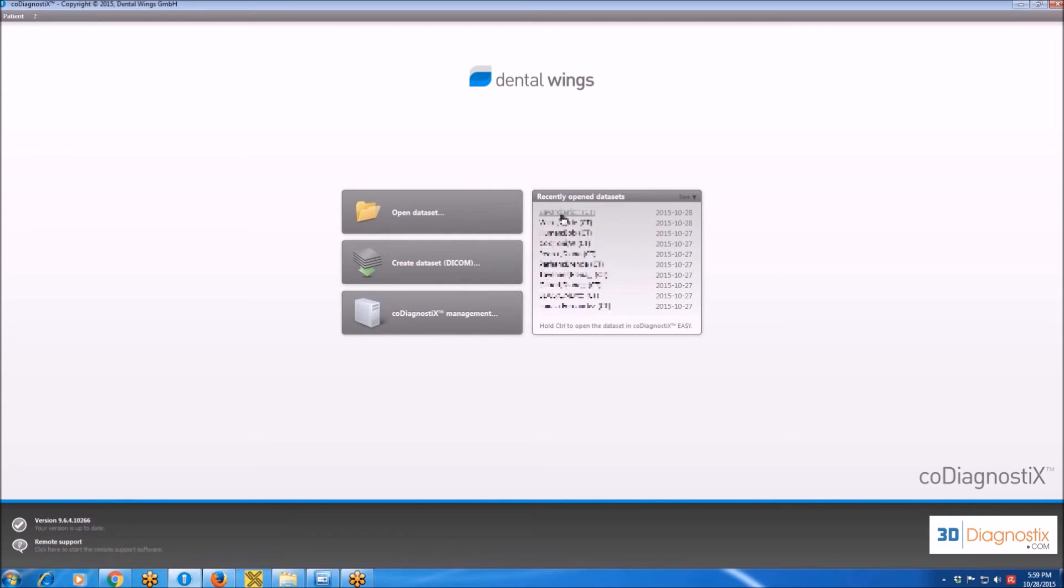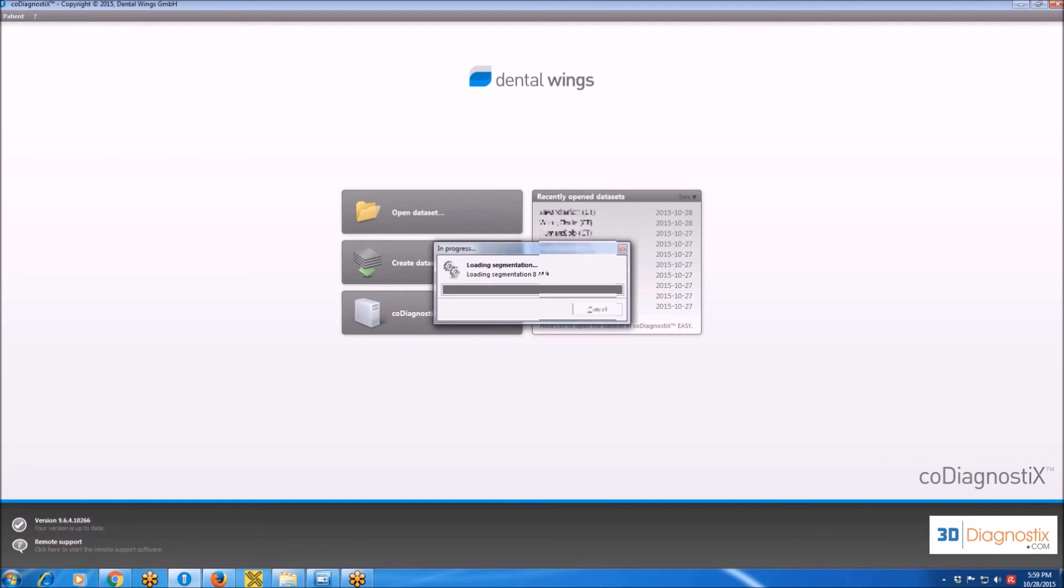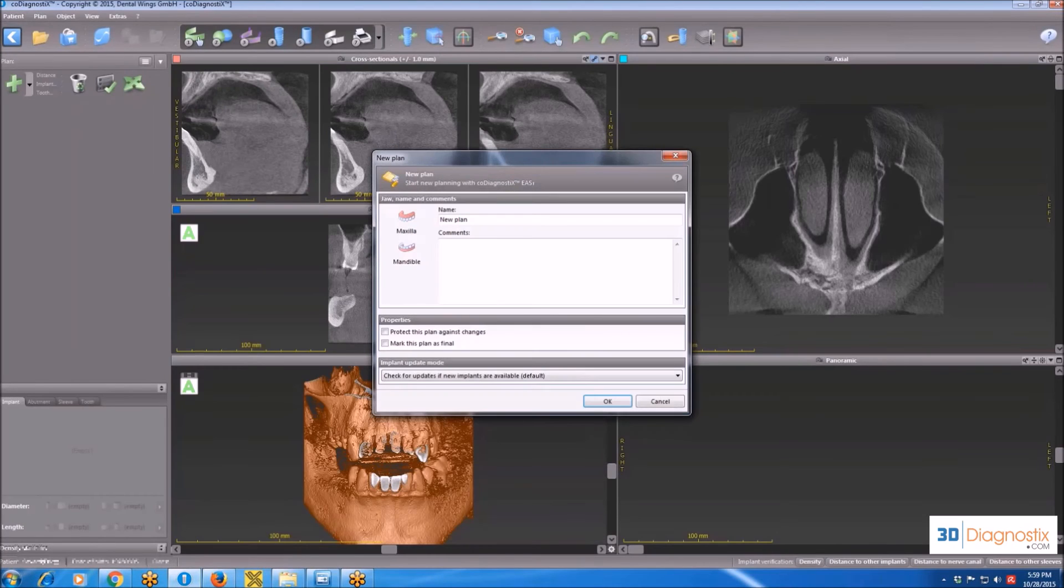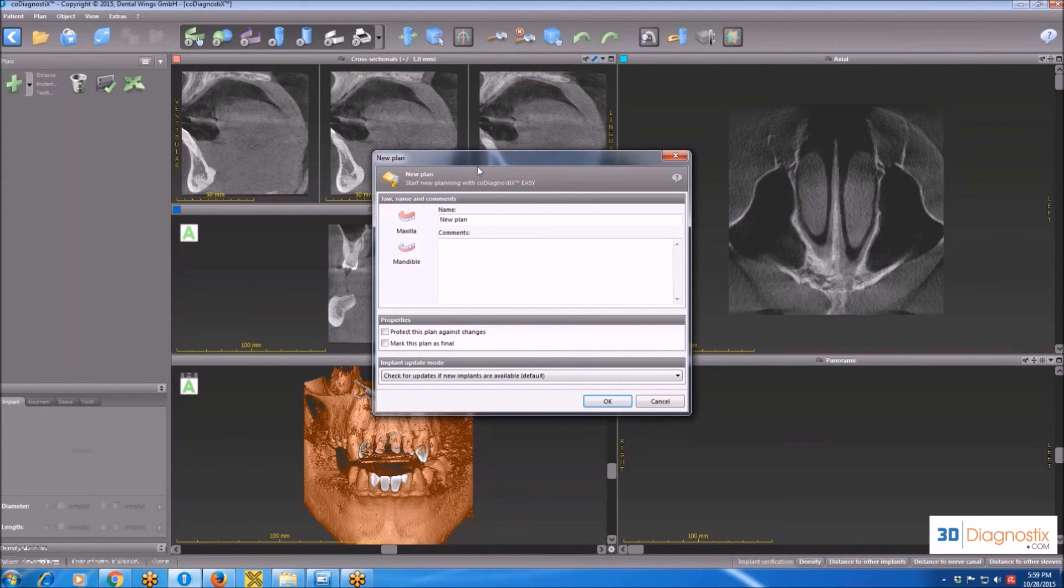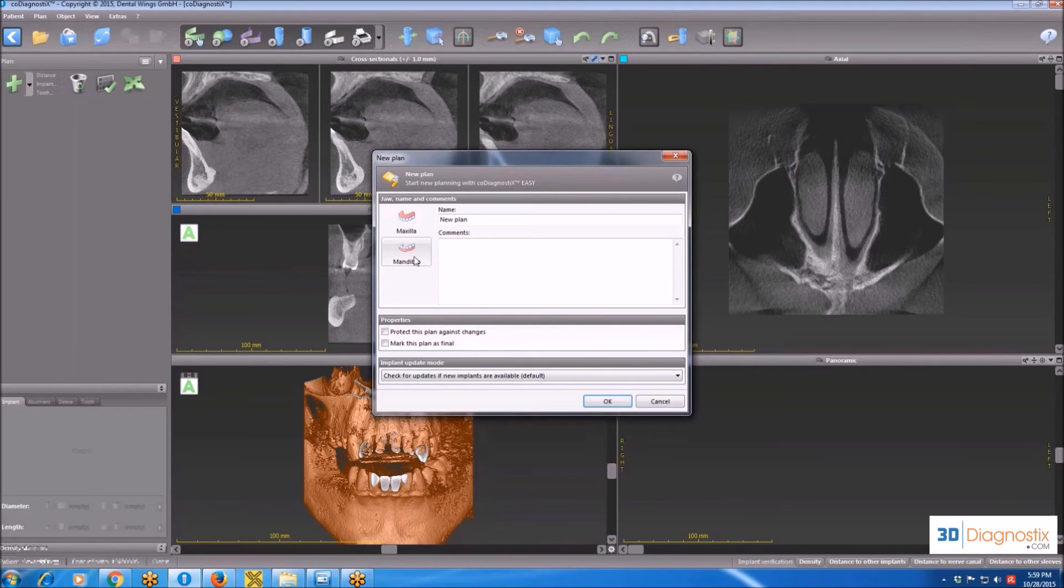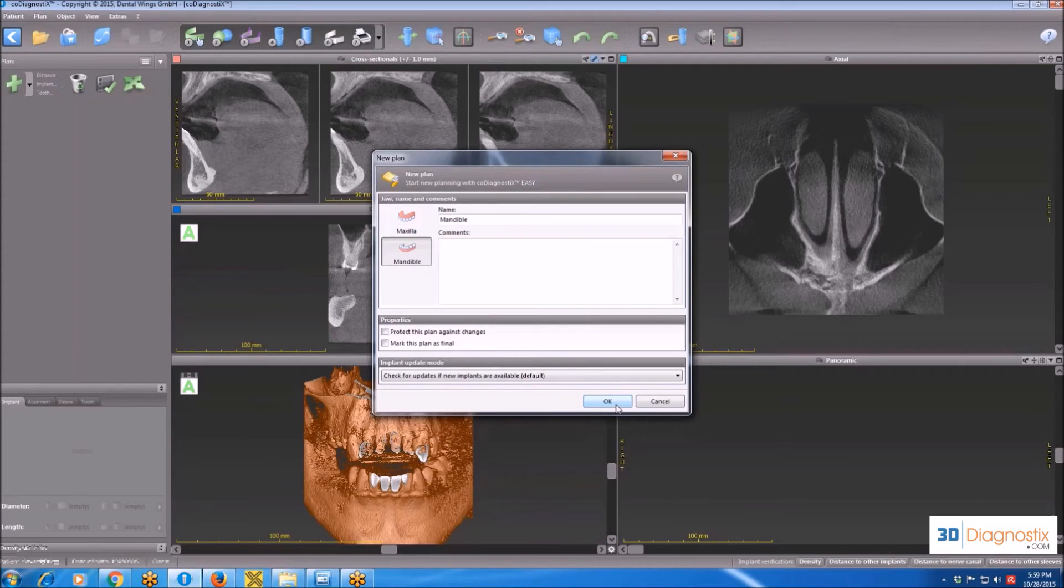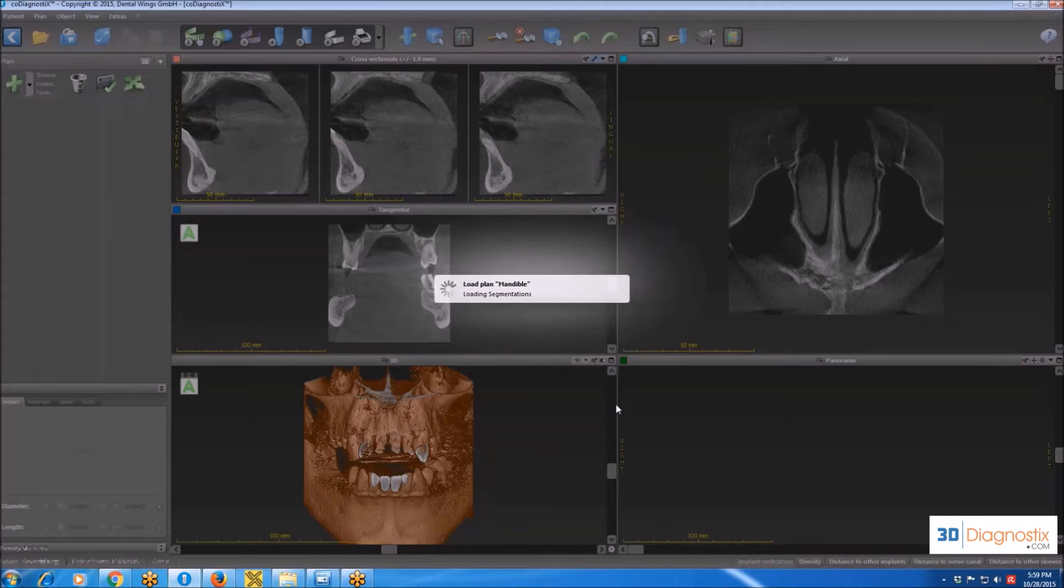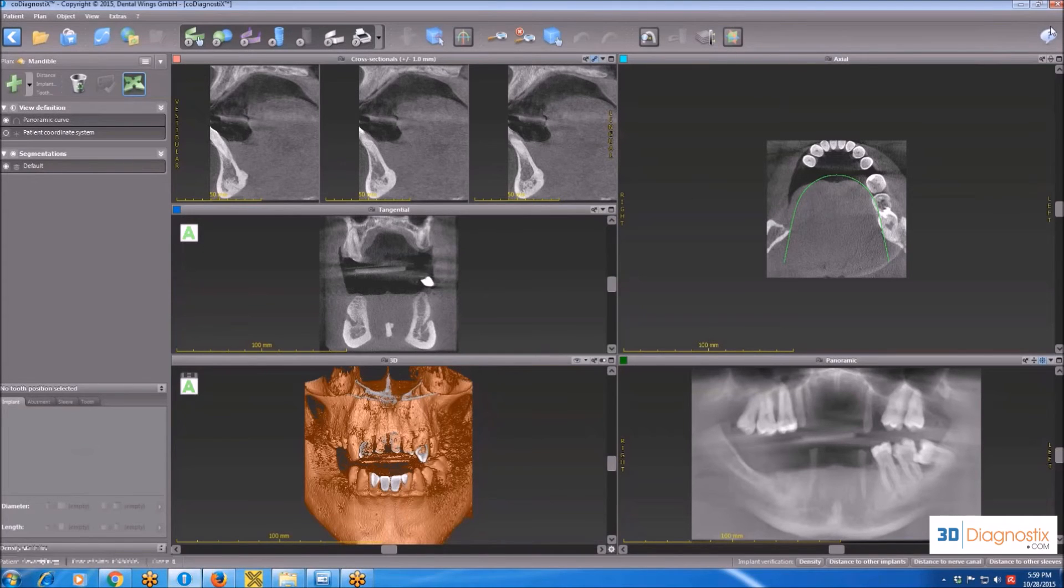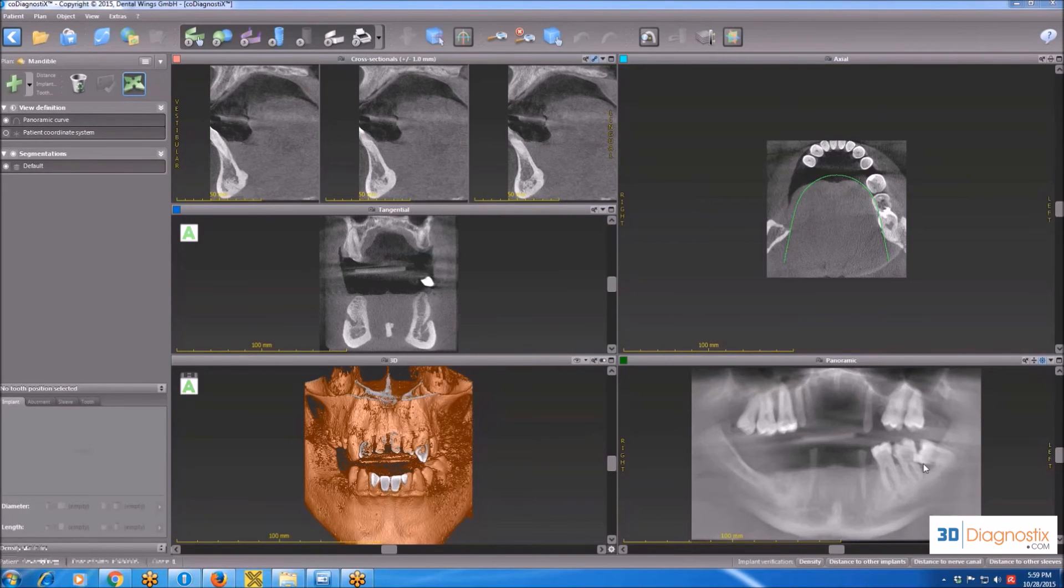Now, after I created the dataset, I'm going to click on the patient's name. And over here, that's the first window I get once I enter the planning software, and it asks whether it is a maxillary or a mandibular case. I'm going to choose Mandible because that's what it is. Click OK. And now that's basically the home page of the planning software.